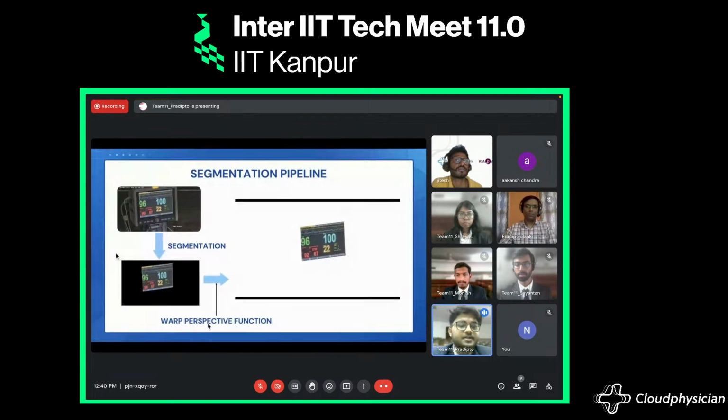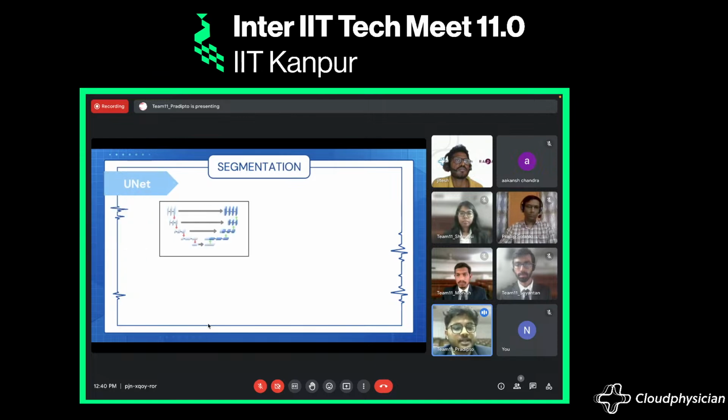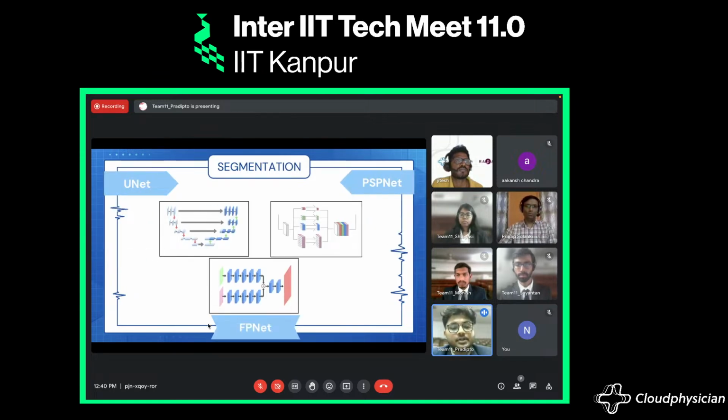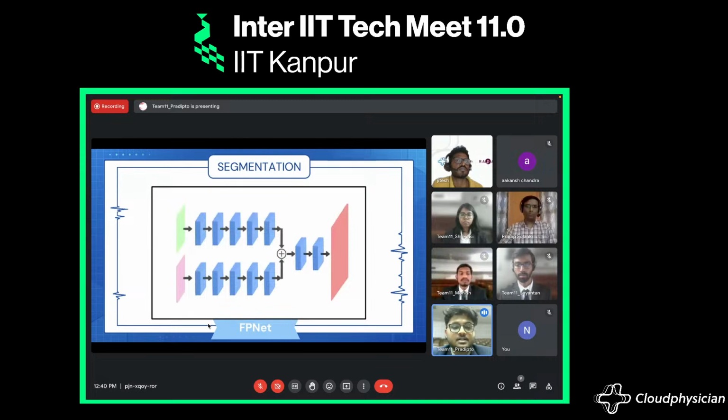Sorry about that. The first step to our pipeline is segmentation. This is a classic semantic segmentation problem with two classes, screen and background. Followed by this step, we warp the screen to generate its top view in order to bring uniformity in screen and text orientation. We experimented on 3 models for this task, namely UNet, PSPNet, and FPNet, with ResNet 34 and EfficientNet V1 backbones for each. We will specifically focus on FPNet, which yielded best results for our case with EfficientNet V1 backbone.